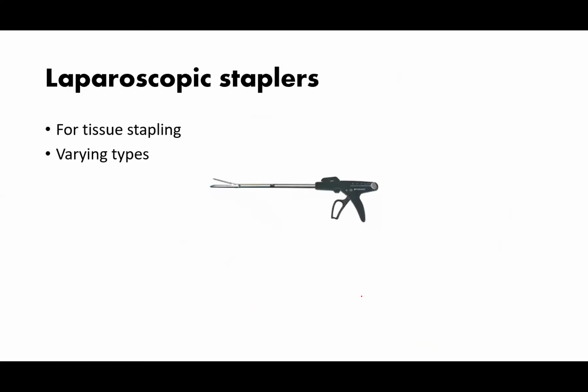Now, laparoscopic staplers, just like normal staplers, you use for stapling anastomosis, for anastomosing bowel. You also use them when you do bariatric surgeries. They are very, very useful in bariatric surgeries, colonic surgeries. So it makes your procedures very rapid.